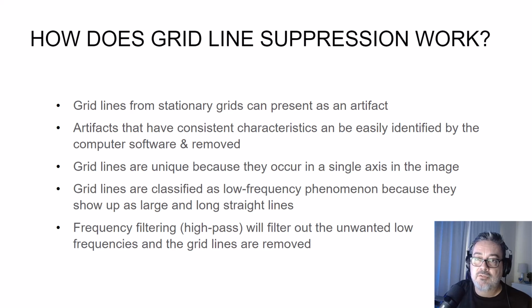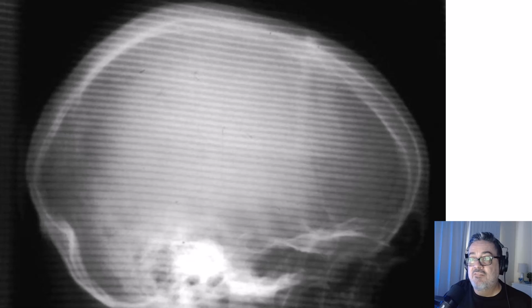from the image. This last image shows what we call an aliasing artifact or moire pattern without the high-pass filter applied. This can typically occur in CR imaging when the grid frequency and image plate scan frequency are too close, but that's a whole other discussion. It's a little more complicated than that, but just know for now that you could acquire a similar appearance of an image if the high-pass filter isn't performed.